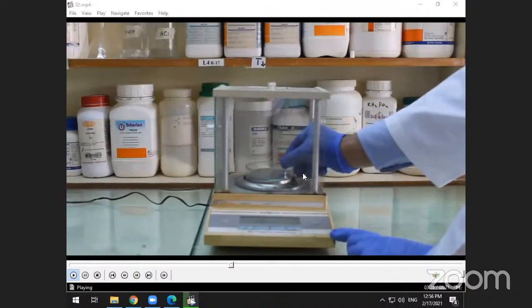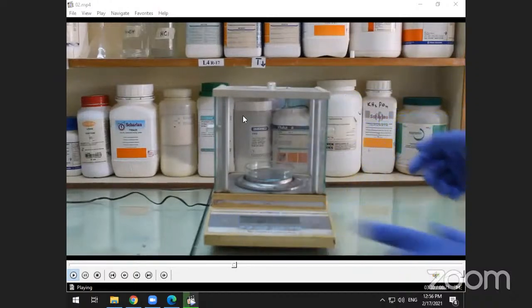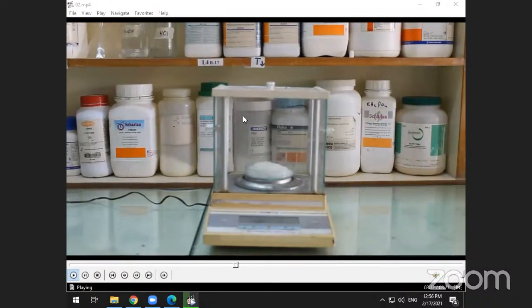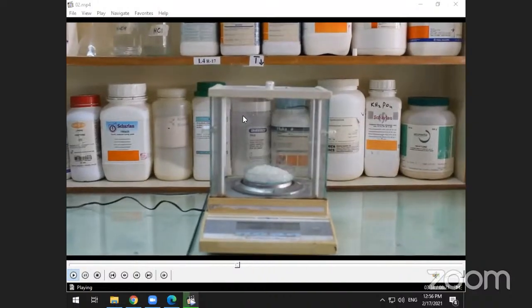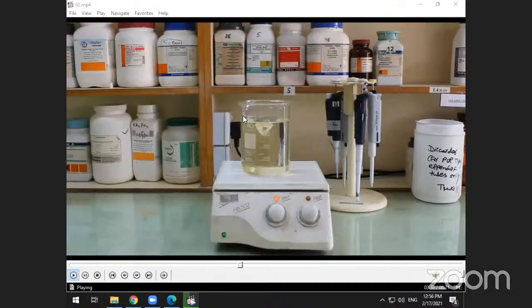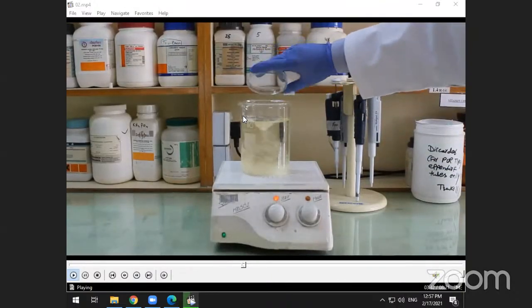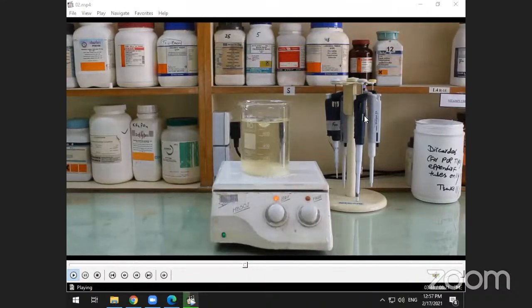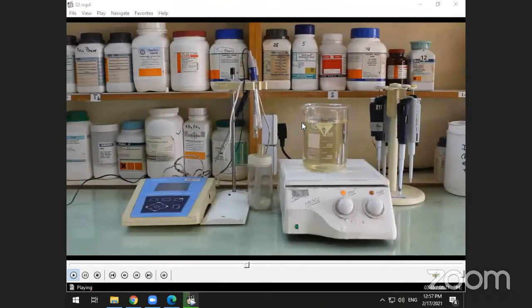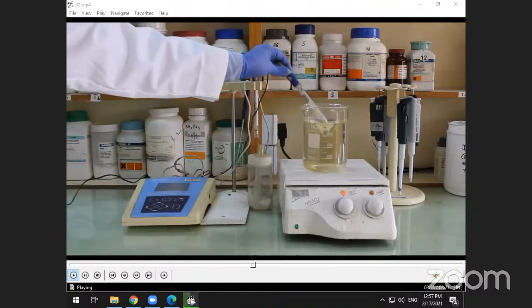Weigh 30 grams of sugar or sucrose for 1 liter of the media. Now add 30 grams of sugar into the media. Adjust pH of the media to 5.7 or 5.8 with 1 molar NaOH or 1 normal HCl.